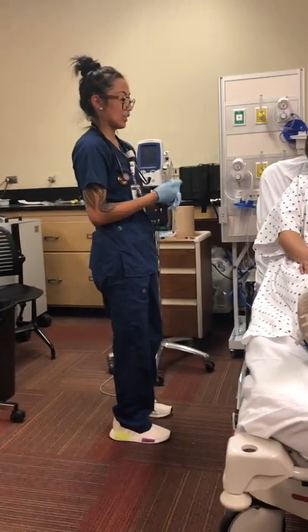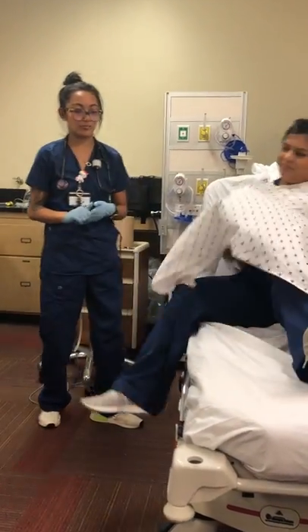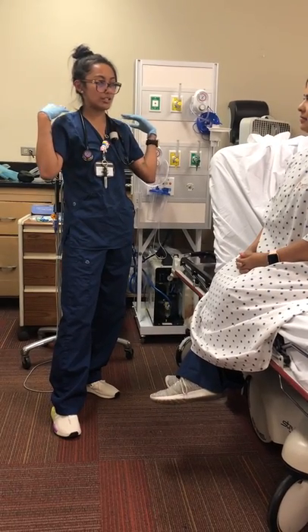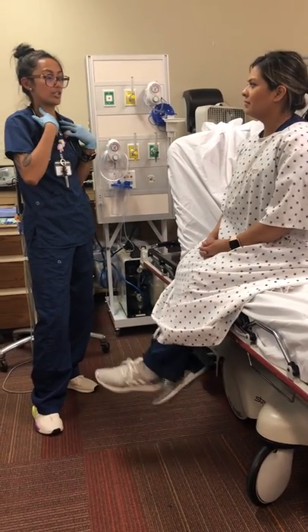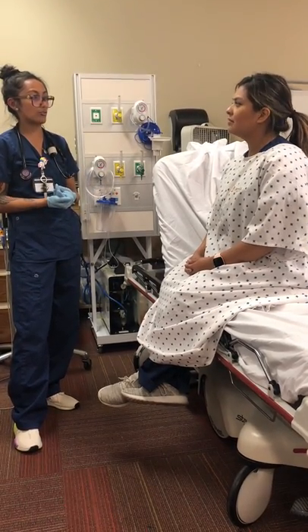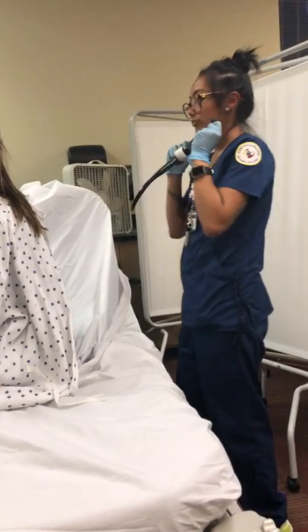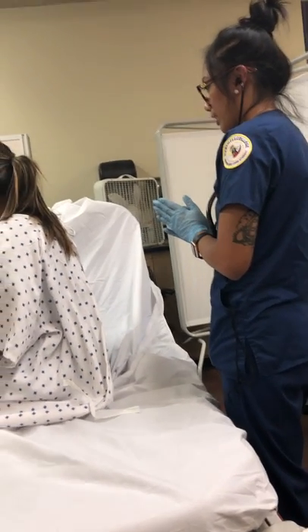I'm going to listen to your lungs. I'm going to have you sit on the edge of the bed. I'm going to do 8 to 10 spots on your back, 2 on each side, and also 8 to 10 on the front, and one more on your neck to make sure none of the wheezing is coming from there or that you have stridor. I'm also going to warm my stethoscope by placing the bell in my hand. When I place my stethoscope on you, I need you to take a deep breath in.